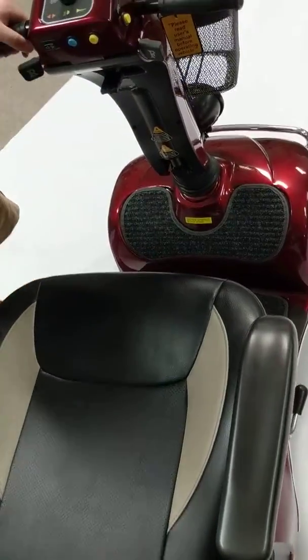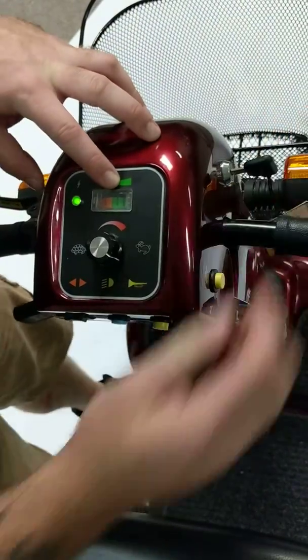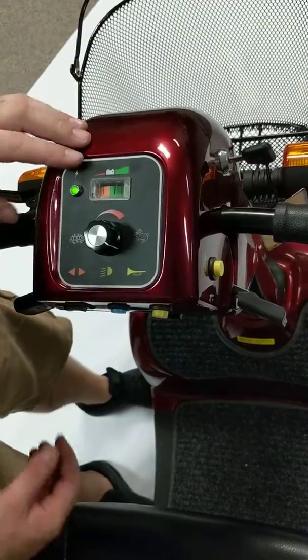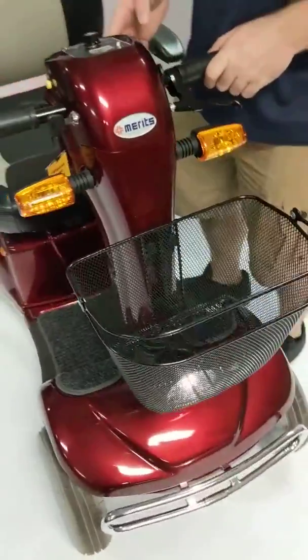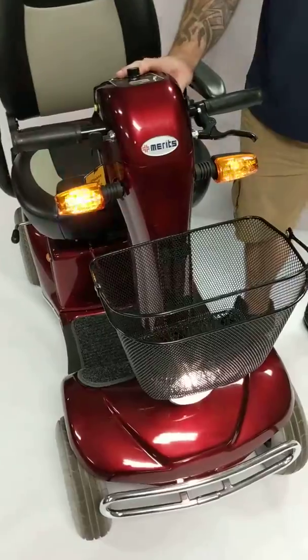This scooter has a full lighting package. This is your battery indicator when you turn the scooter on — green is good, red all the way means it's going down. You have turn indicators for the left side and right side, and you have hazard lights that you can put on here.